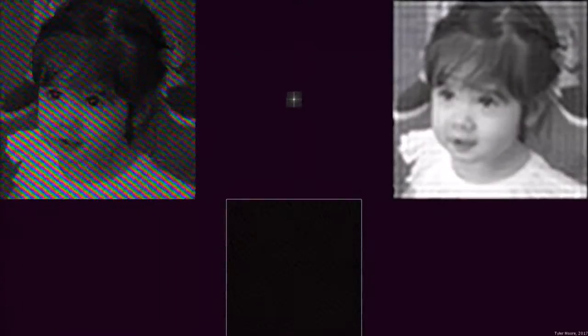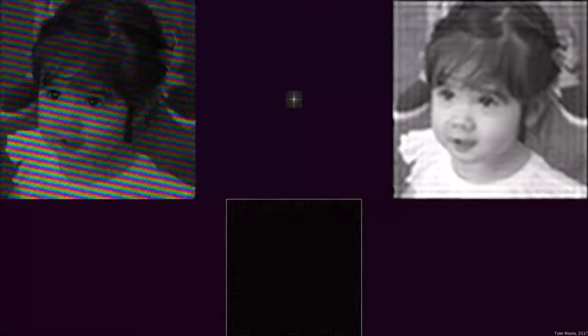Here is an example of 2D Fourier transform with a real image. In the top left is the source image. In the top middle is K-space, which is filled by performing a Fourier transform on the source image. In the top right is the reconstructed image, which is formed by taking the inverse Fourier transform of K-space.